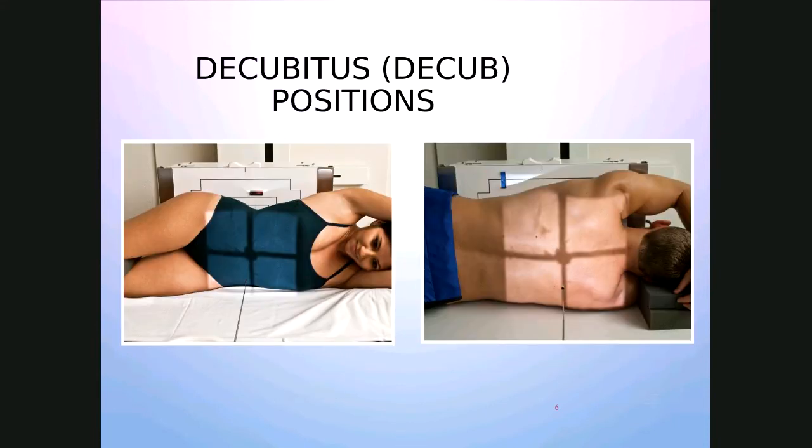When I was telling you that one is AP and one is PA, this is all I mean. Now, granted, different patients, but she is actually lying in a left lateral decubitus view. Now, granted, you can see this is of her abdomen, but the point is that she's still facing us. So this one is AP, and then when you roll and they're on their right side, now their back is to you. So this one is AP, one is PA.